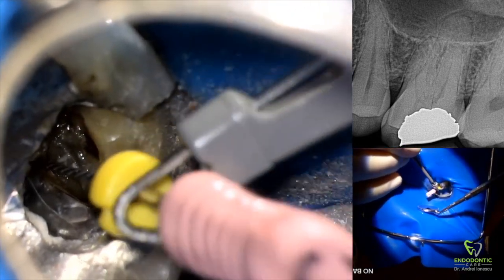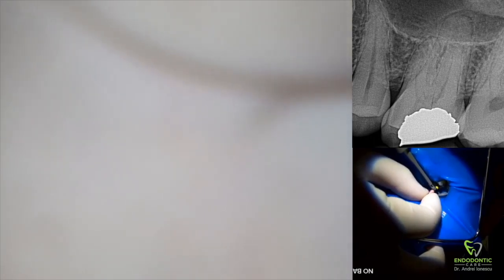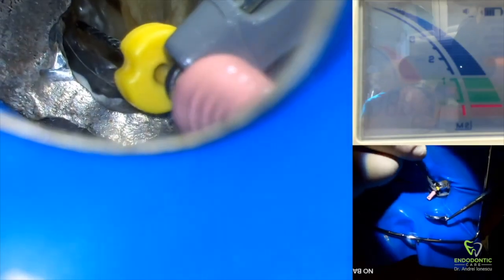We'll hook on the apex locator, pass the file through the apex — you can see a little bit of red on the apex locator — and then gently pull back on the file until the reading is right at the bottom of the green. Once we get a pretty stable reading at the bottom of the green, we stop and take that as our preliminary working length of the distal buccal canal. That's our length.